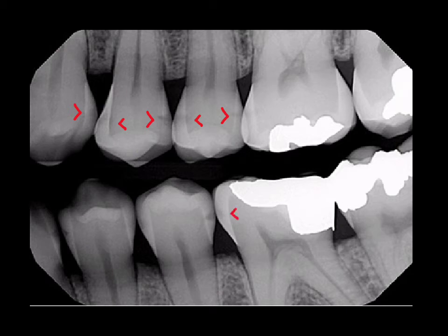Dropping down to the mandible, it looks like there is incipient decay on the mesial of 19 and probably beyond that on the distal of 20. Incipient decay, likely incipient decay, a little more pronounced on the mesial of 21 and the distal of 22.